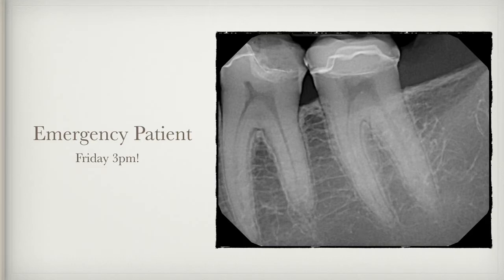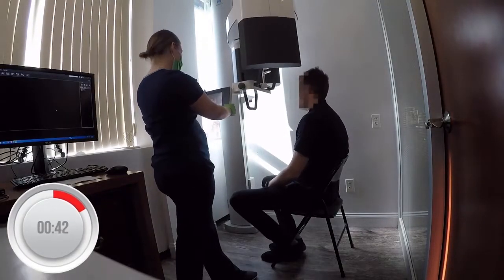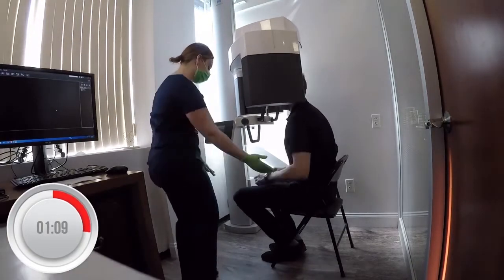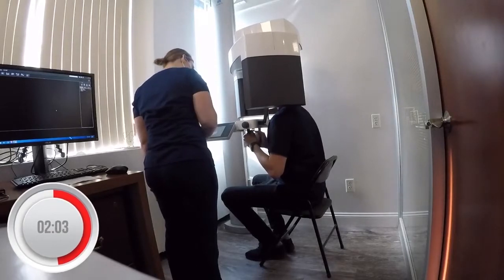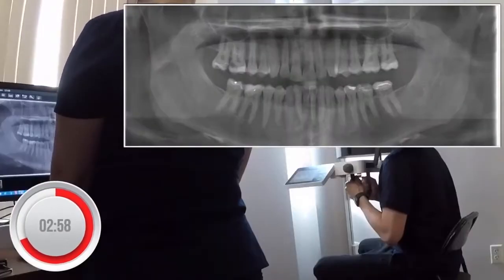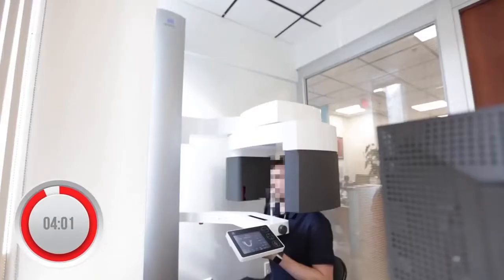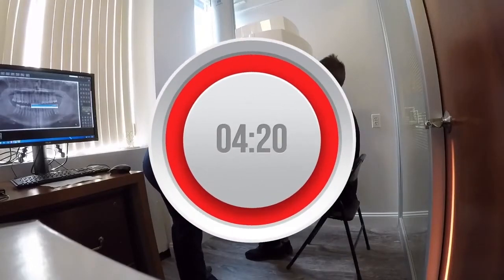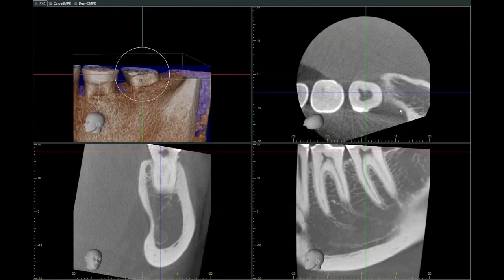We figured we'd take a CBCT to see what kind of anatomy we have so we can do the treatment. I wanted to showcase how long it takes to take a CT image once your staff gets pretty fast at it. This particular unit, the X800, can go up and down — this patient was pretty tall, so we ended up having him sit down. The key is to have a patient that is completely still. What's nice about the X800 is that it allows you to take a very high quality pan first, then the assistant scouts the image to the location where you want to take it, and it can almost do an auto exposure with an additional rotation for much higher resolution. In just a few minutes, the image pops up on the screen.